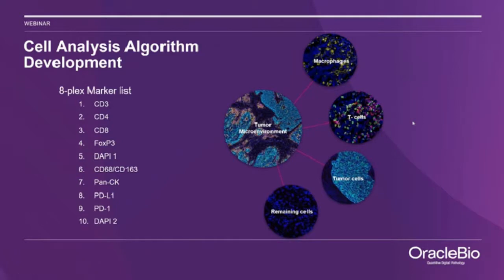When it comes to the first part, which is the cell identification and segmentation, as I mentioned, the tumor microenvironment does contain a lot of different cell types. For example, macrophages, which can come in different sizes from small to large, and also different shapes with respect to either roundness or spindle-shaped cells, depending whether they're moving through the tissue. And then moving into something like T cells, which are smaller than macrophages, more rounded. They can be individual cells, or they can also be found in clusters.